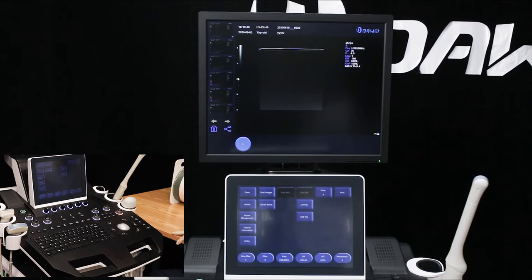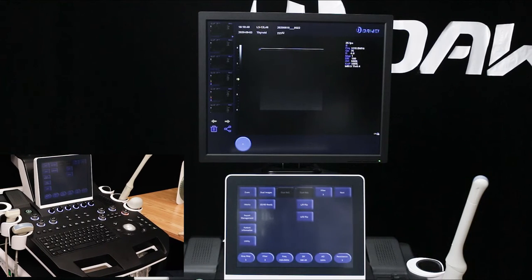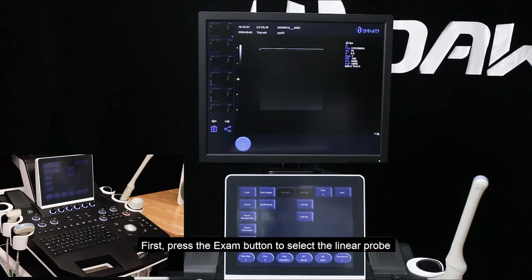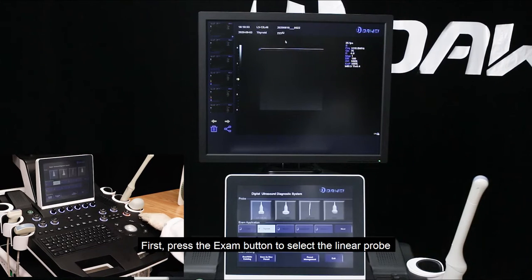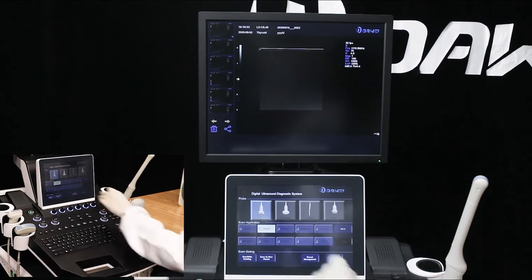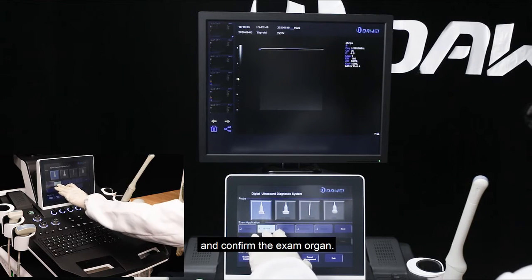Demonstrate trapezoidal imaging. First, press the exam button to select the linear probe and confirm the exam organ.